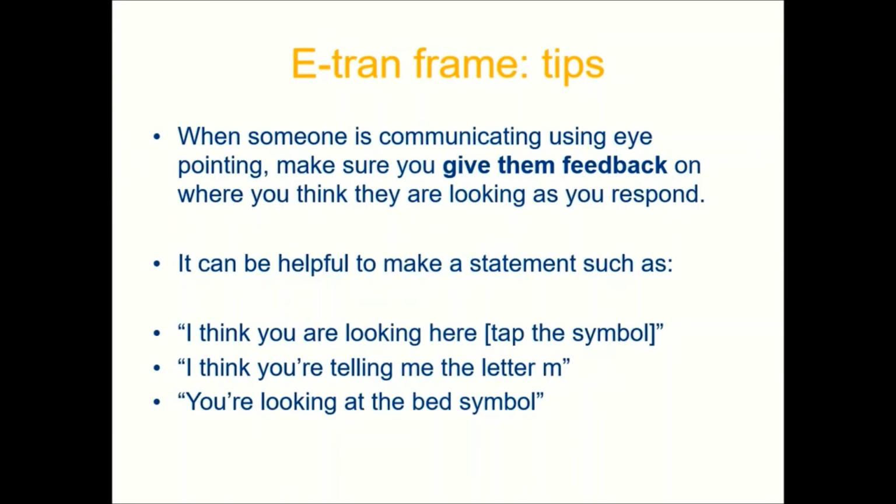Some tips for using an eTran frame. Try and make sure you give them feedback. So it can be helpful to have a running commentary. It's just to confirm their choices, to say, I think you're looking here, and then you tap the box or the symbol. I think you're telling me the letter M, or you're looking at the bed symbol. And hopefully you'll notice from their body language if something's not quite going right.